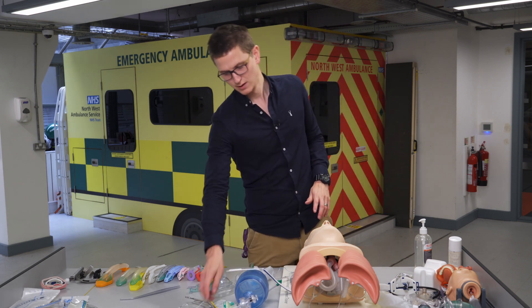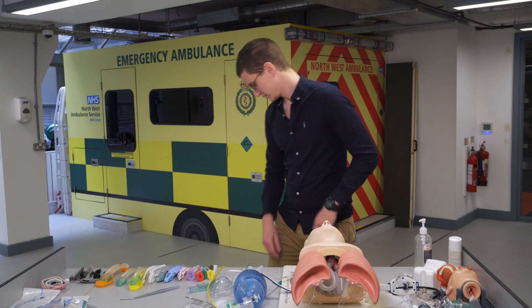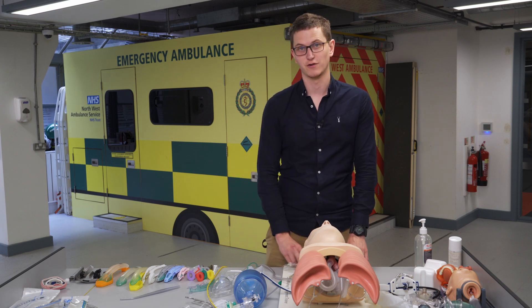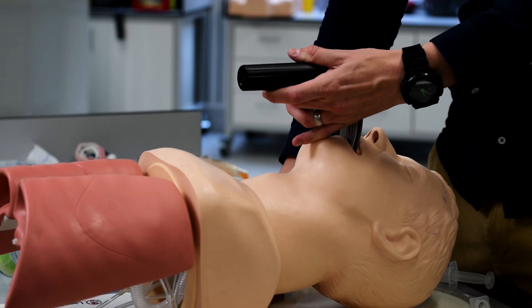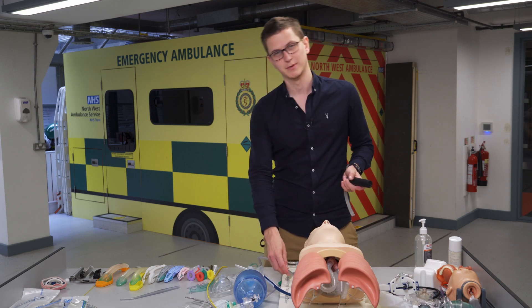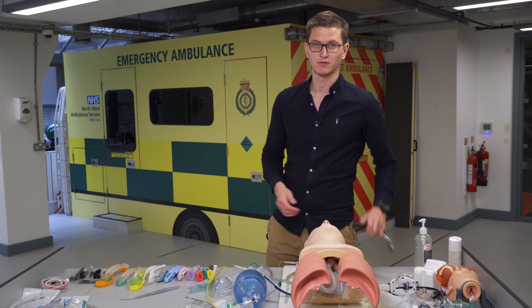You also need your BVM with HME filter, catheter mount, and capnography — all vital. Suction is also critical and goes under the right shoulder, because that's your free hand. While the blade is in the mouth, your right hand can grab the suction. While the blade is in the mouth, the patient is not being ventilated, so it's important to be quick and successful on the first try.